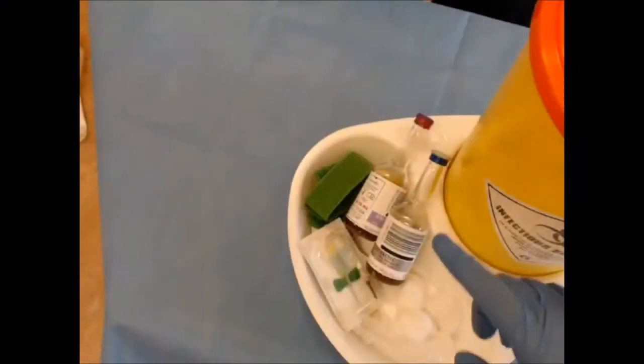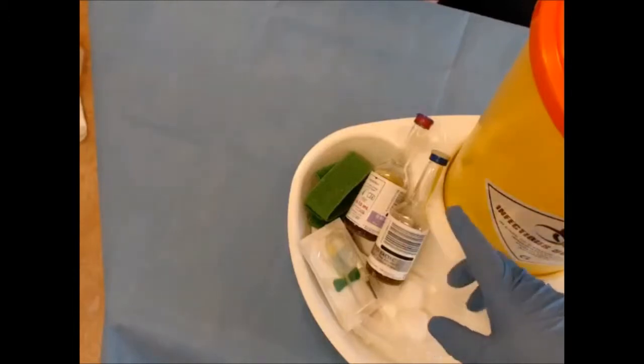So we're going to do blood culture from a peripheral vein today. Here's the equipment that you need.